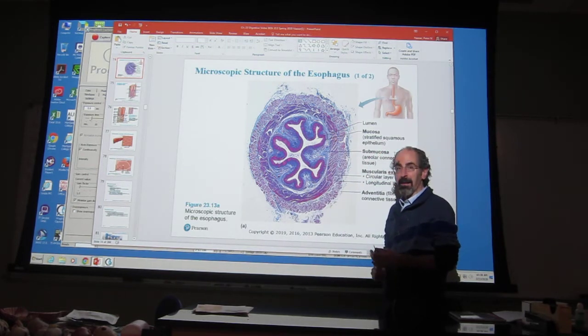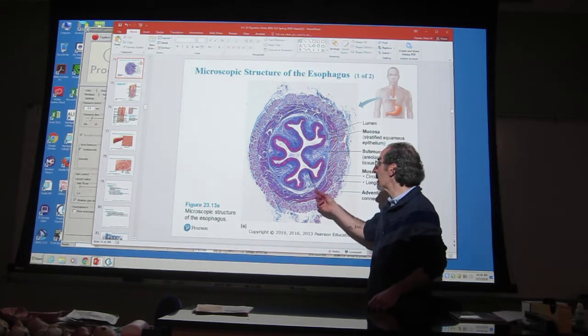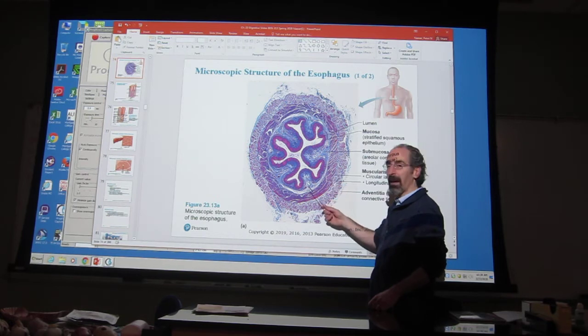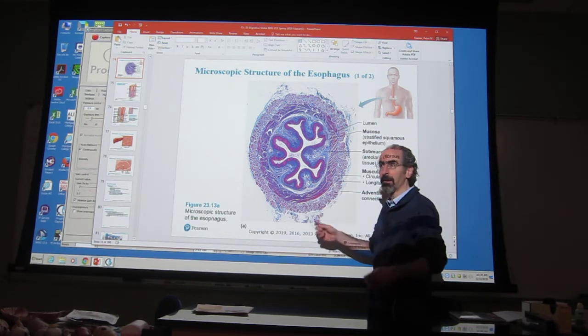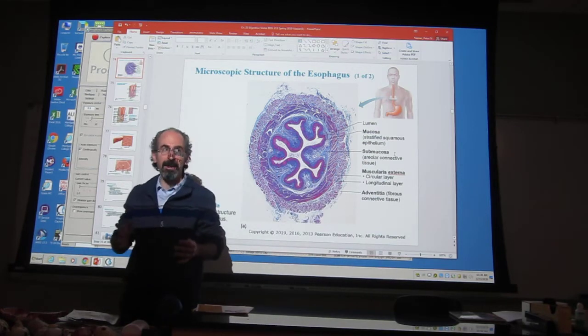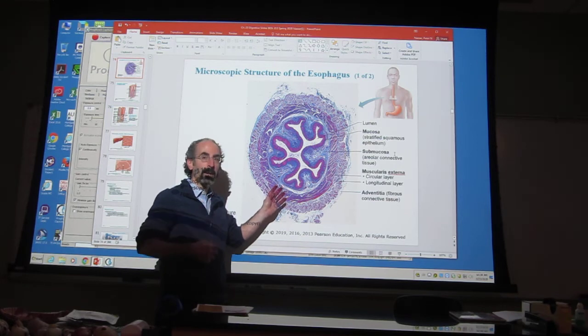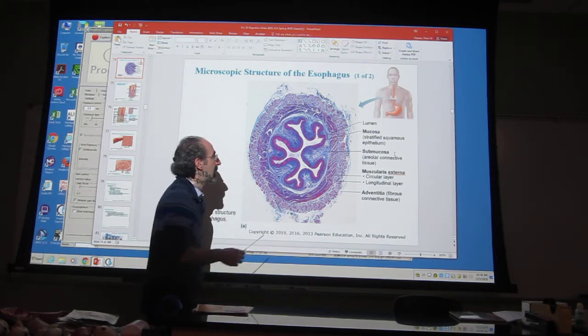Okay, a typical esophagus looks something like this. This is a slide from your textbook. I just want to start with this to give you some context. In all of these slides, we're going to be looking for 4 tissue layers, because the organization of the gastrointestinal tract, for the most part, is the same. What is really amazing, though, is that depending on where you are in your GI tract, the tissue layers are modified to specialize to do certain types of things.